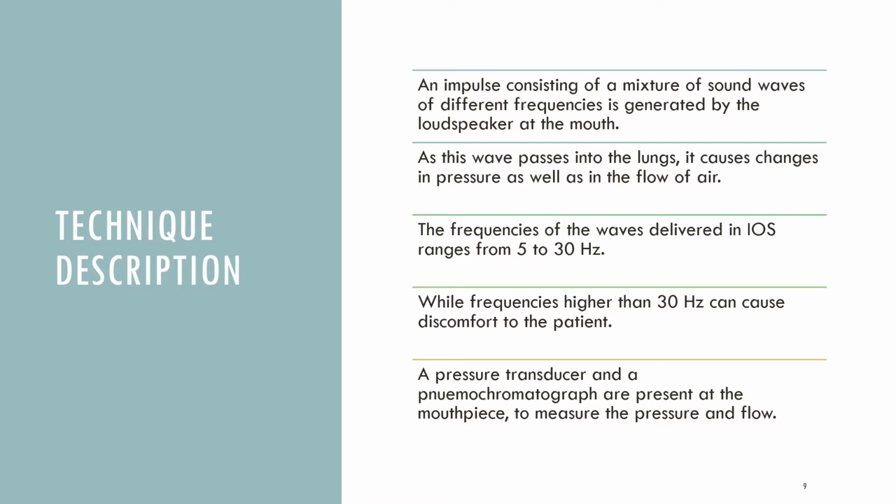This is where they get a graphical display of pressure and flow, and this is all superimposed with the sound waves that come along with it. From this, you can do great interpretation of exactly what kind of problems you have with your lungs.